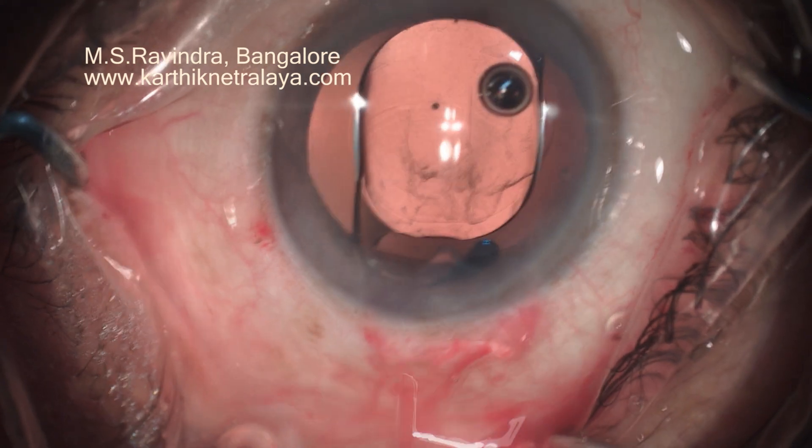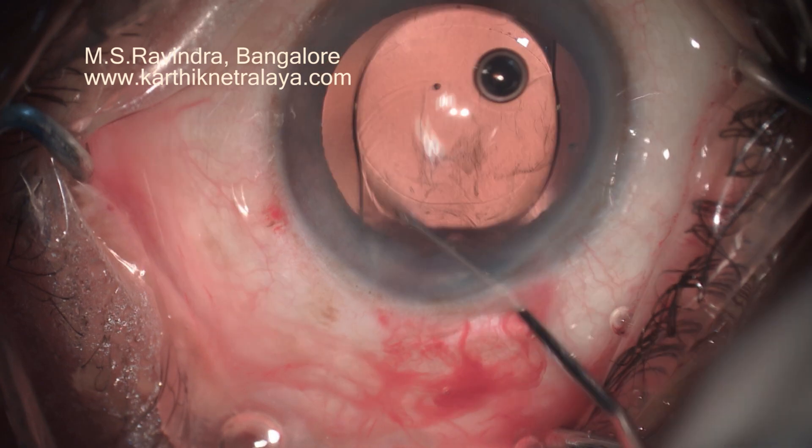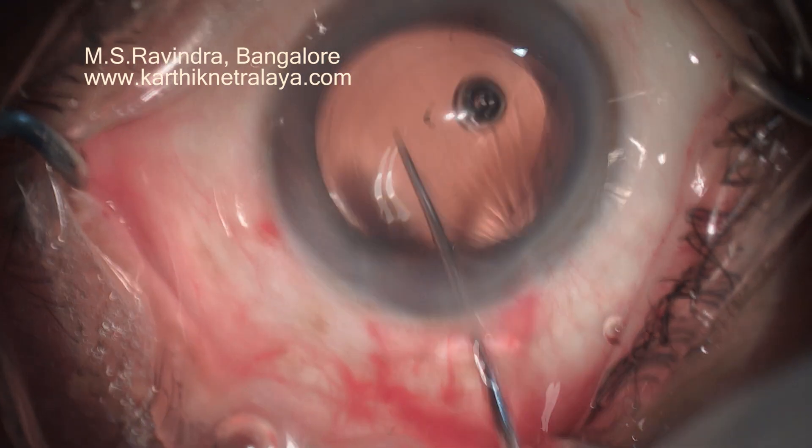It's a very elegant technique. This tunnel is not stretched, so there is no need to hydrate it. There is no need to suture this tunnel, and the eye does not need a bandage.